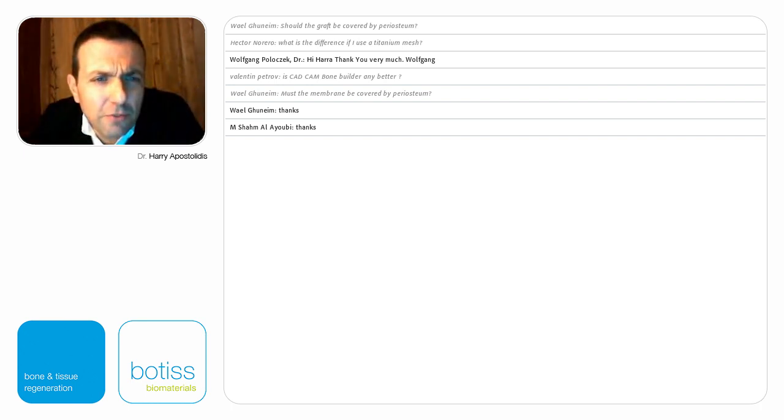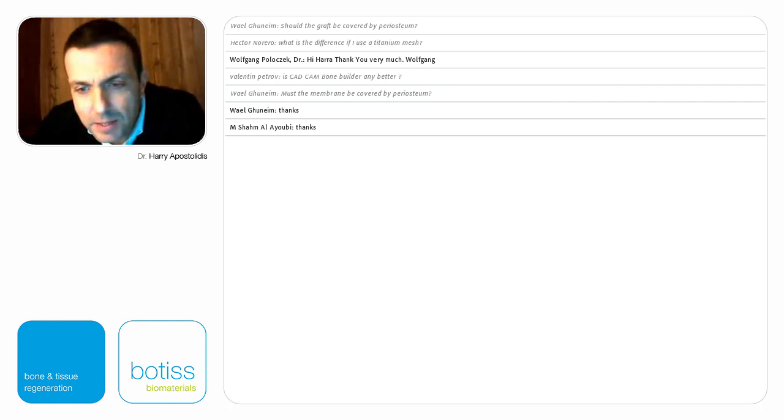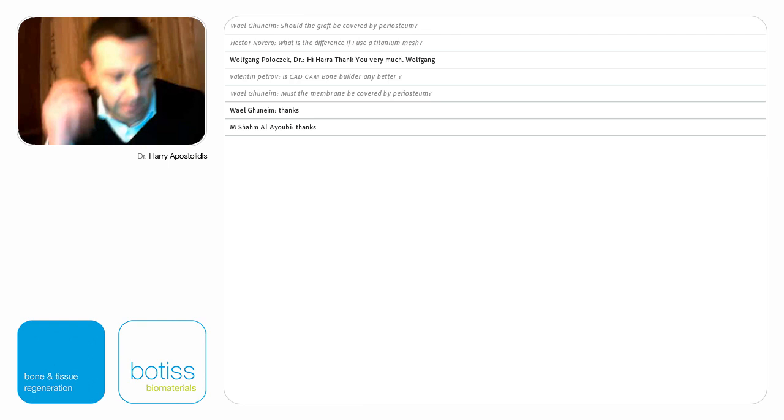Dr. Petrov, is CAD/CAM Bone Builder any better? Well, I haven't used it. From my experience, if I understand your question correctly, CAD/CAM Bone Builder is allogenic bone. I don't use allogenic bone blocks. I don't trust them.